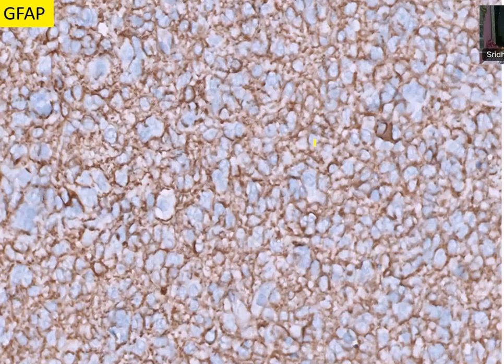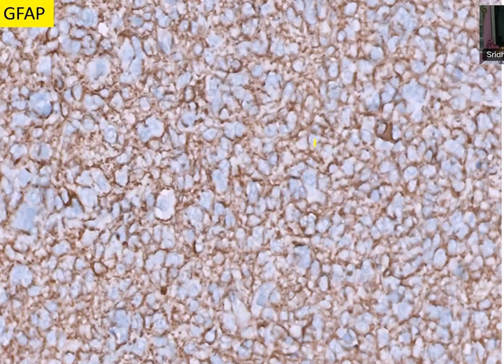So first, you have to think: am I dealing with an embryonal tumor? Am I dealing with a glial tumor? Am I dealing with a glioneuronal or a neurocytic tumor? That is why I showed you these markers. Synaptophysin is weakly positive. If you're thinking of a neurocytic tumor, synaptophysin should have been stronger. Yes, they can be GFAP positive, but weak. Here synaptophysin is weak positive, GFAP strong positive. So probably synaptophysin is aberrant or not specific. GFAP is stronger. Will you still be able to think of a differential of embryonal tumor?